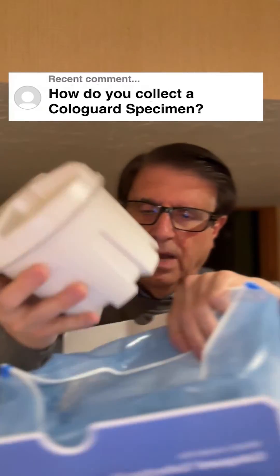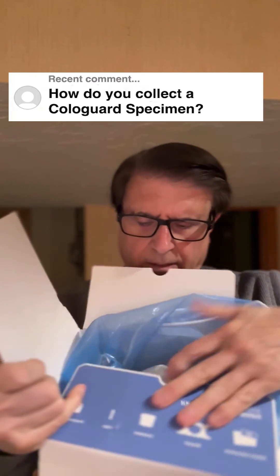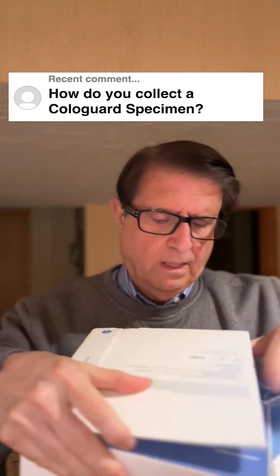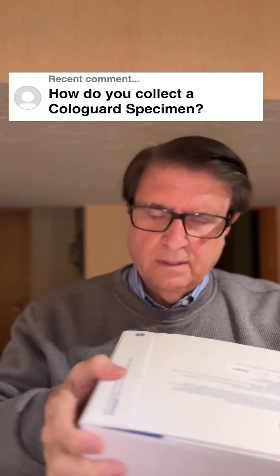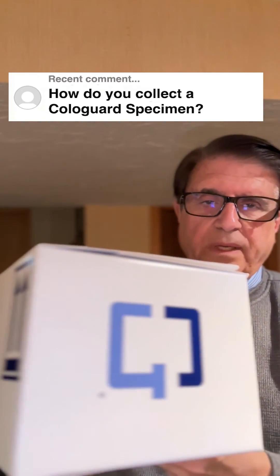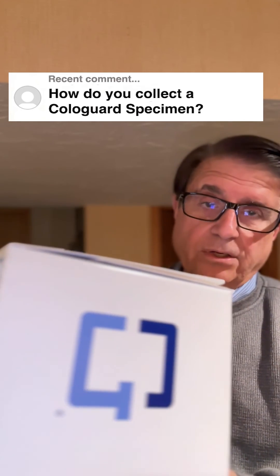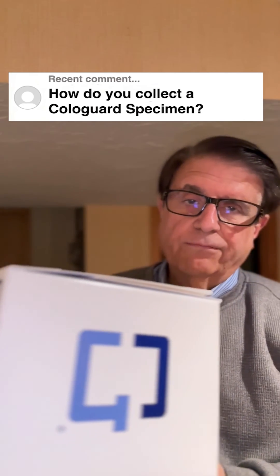Then you put it back in this box, in this plastic bag, and it seals up. And you take the box to your local UPS. The postage, I believe, is free — it's a $600 test, so it should give you free postage.